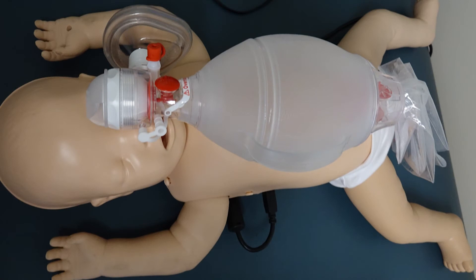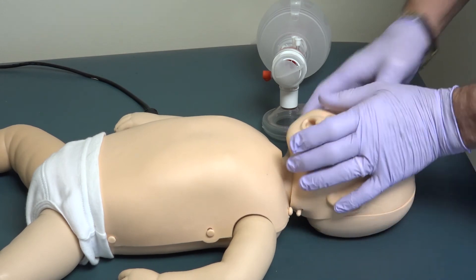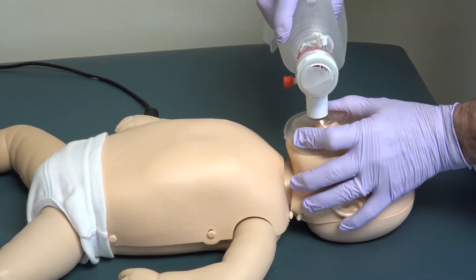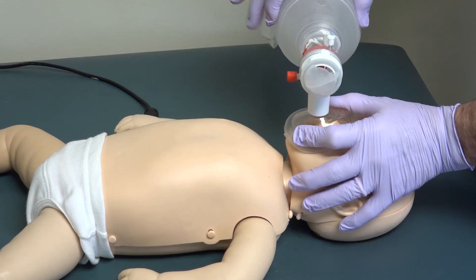When doing ventilations on the infant for BLS, you will need to use a small bag valve mask suitable for the infant mannequin. Gently pull the head back — it works best when it is level. Put the mask over the mouth and nose while holding it on tightly and gently squeeze the bag. You will see the stomach slightly expand. The program will also give you feedback for the infant as well.